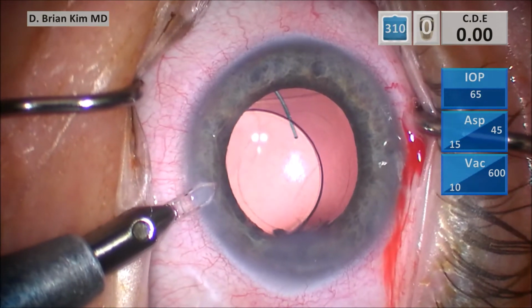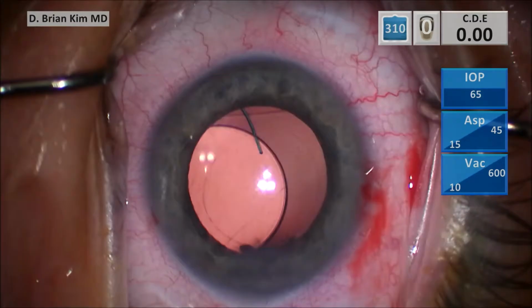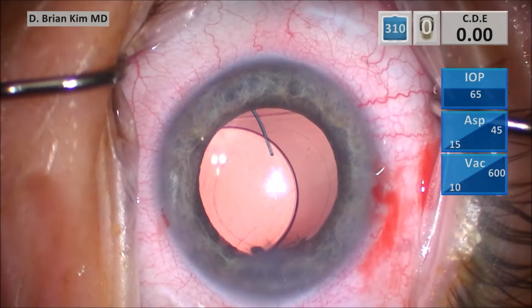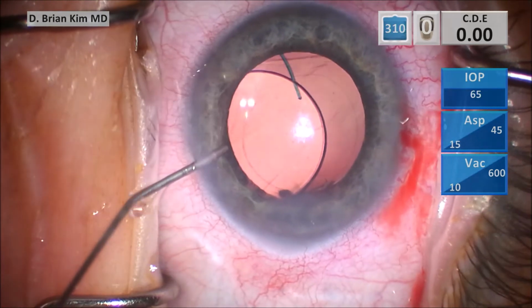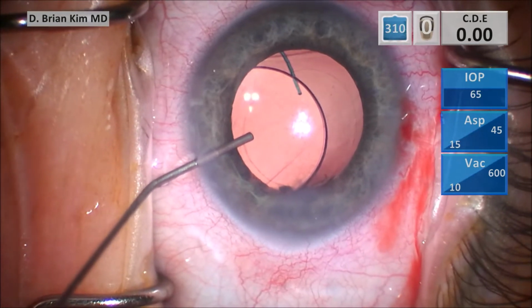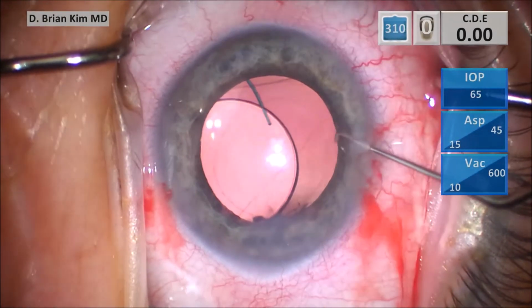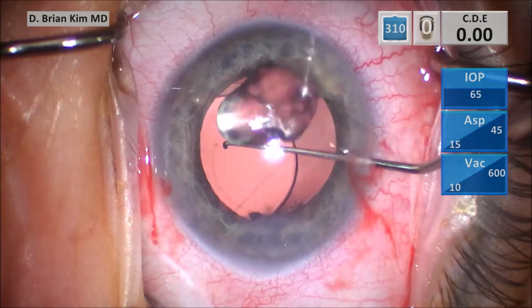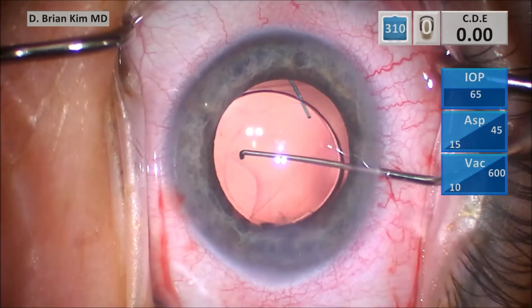So I make my incisions first on the right side and then the left side. I'm injecting some intracameral lidocaine. And then I'm using the Sinskey hook. Again, this lens is in the ciliary sulcus.